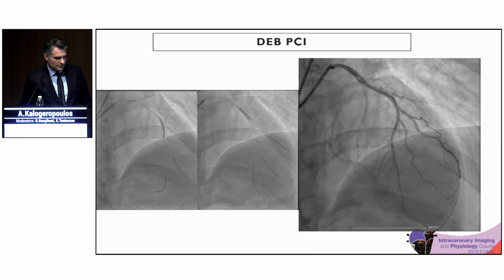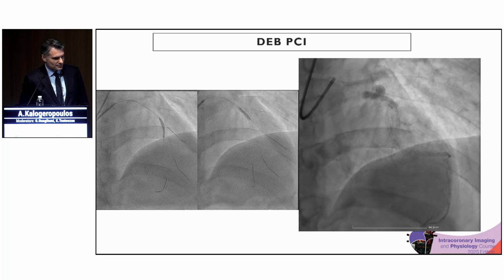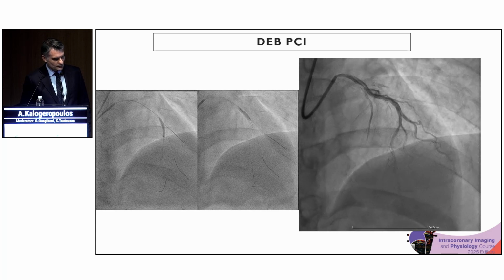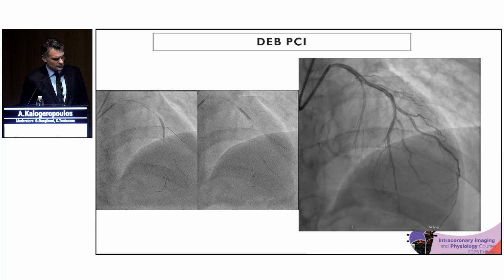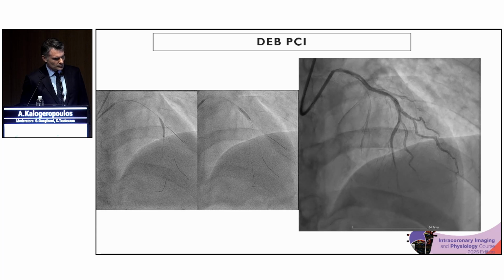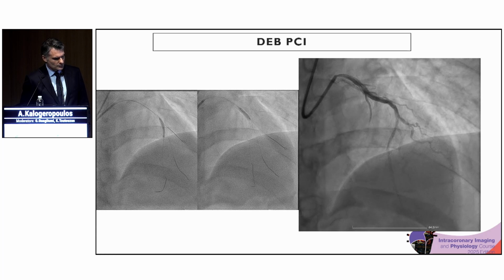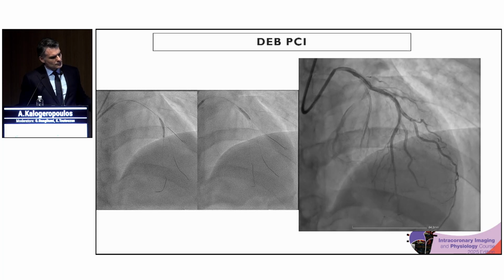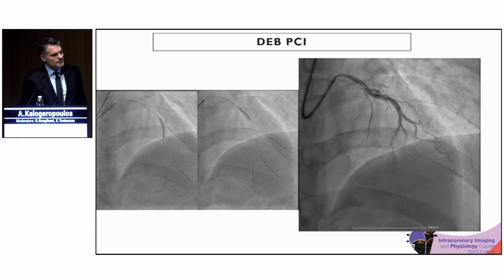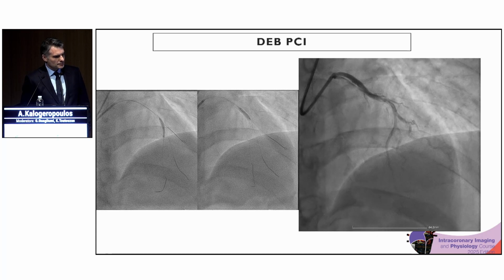That is in line with the hematoma. You can see it at the end of the injection. That is important. The way we are checking is how much we gain in terms of lumen. We try to get medial dissection, but hematoma is a different animal, and we need to take it into consideration when we are judging the results.